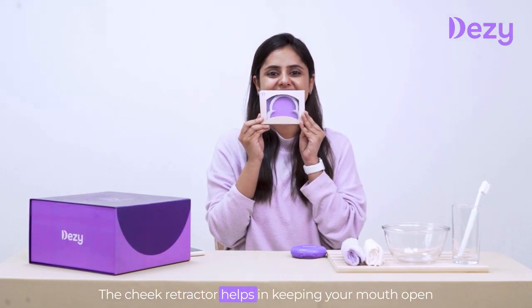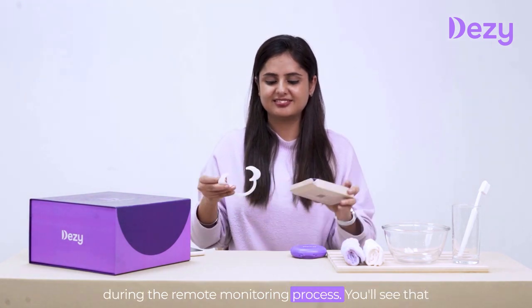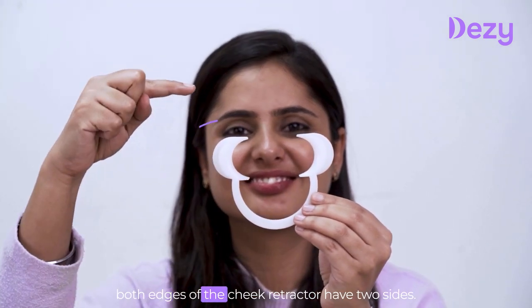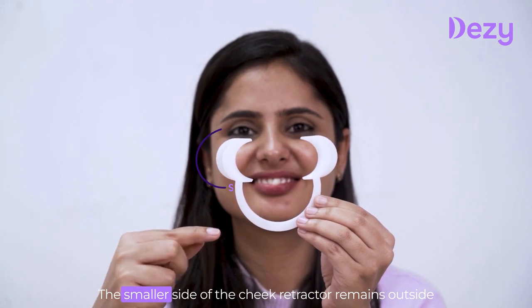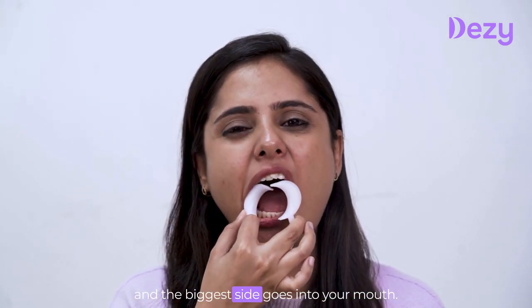The cheek retractor helps in keeping your mouth open during the remote monitoring process. You will see that both edges of the cheek retractor have two sides — the smaller side of the cheek retractor remains outside and the bigger side goes into your mouth.